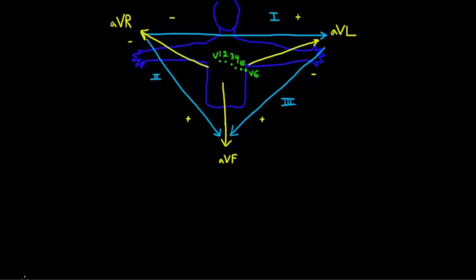Okay, so this is the third video in the section on coronary anatomy, and now we're going to correlate myocardium with the EKG. You should be familiar already with the EKG and the leads as I've set them up, but just to briefly review, remember leads 1, 2, and 3 are bipolar leads. And basically, think about it this way.